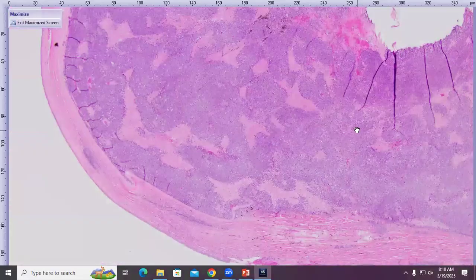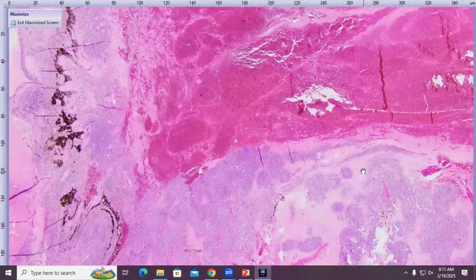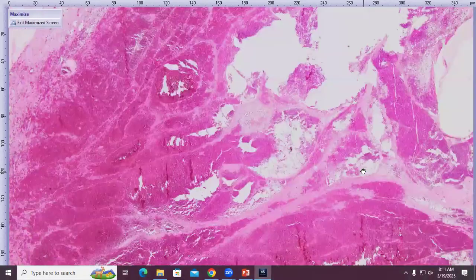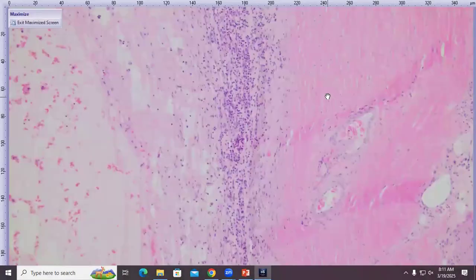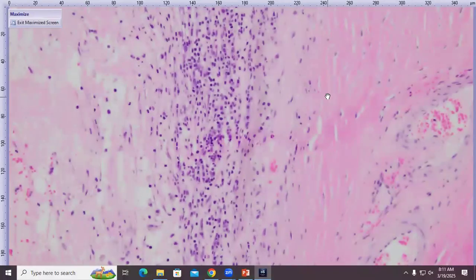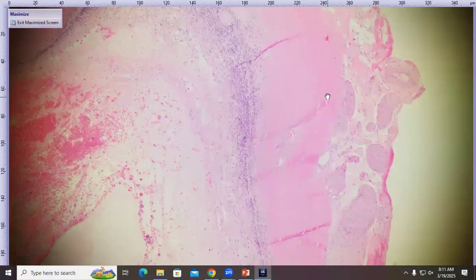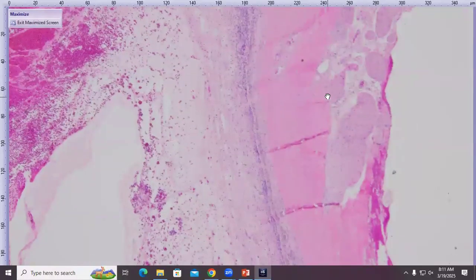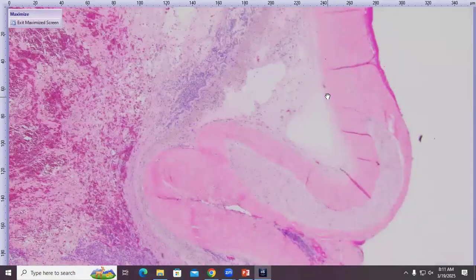As I mentioned, there was no evidence of lens capsule anywhere in this globe, so presumably this cornea ruptured and the lens was extruded. And so now it is an aphakic globe. Let's see here. So there is quite a bit of hemorrhage, which is probably originating from the neoplasm itself or something else. This band of purple around the back, this is the choroid that is infiltrated by, once again, those lymphocytes and plasma cells, part of that lymphoplasmacytic panuveitis. The retina probably was detached, and I'm not sure where it is now. It could have been completely and diffusely atrophied. It could have also undergone necrosis, depending on ischemic events and such. So that is this case.